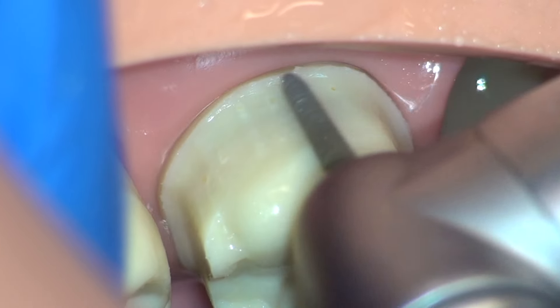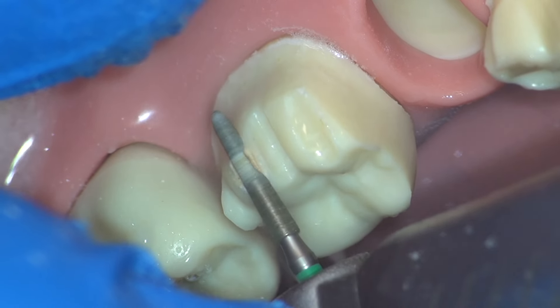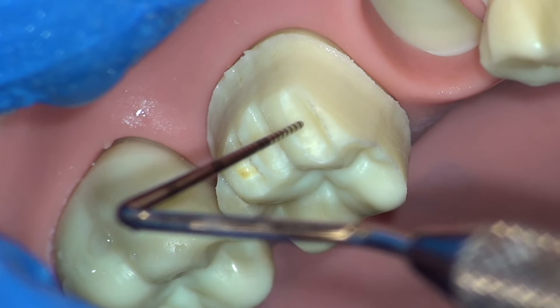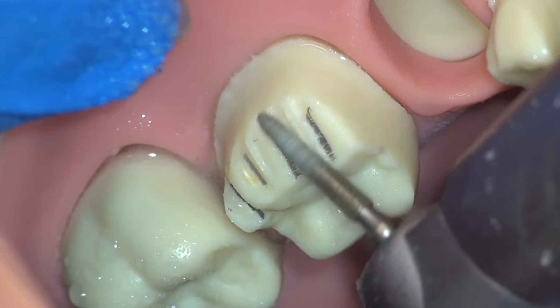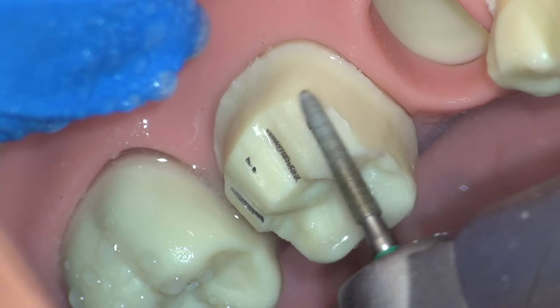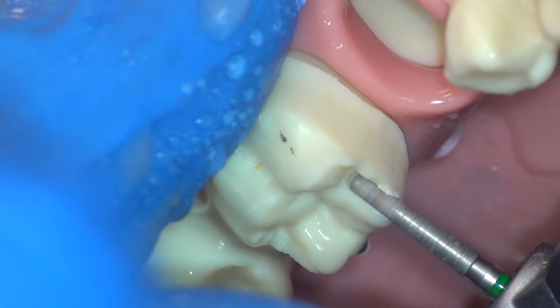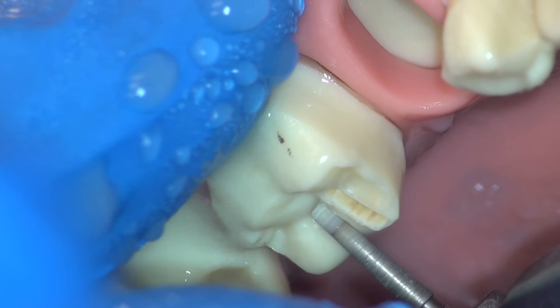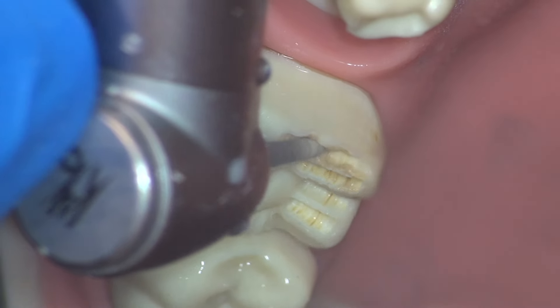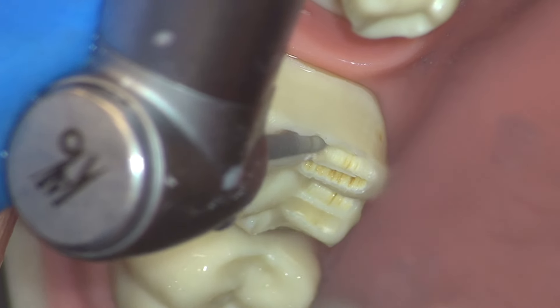Next, we move on to our functional cusp bevel. This functional cusp bevel reduction should be about 1.5 mm and we'll go ahead and set those depths now. We'll check with the probe to ensure that we are at the correct depth — again, we want to go to our final measurement at this time, and I marked that depth with the pencil in the same way as we did on the buccal. The lingual nonfunctional cusp should be reduced 1 mm, which is the width of the end of our modified shoulder bur, so we'll switch back to this burr for the occlusal reduction. We go ahead and set it to that depth of 1 mm and place similar depth grooves on the functional cusp, which should be reduced 1.5 mm. We'll check our reduction with the probe and modify as necessary to reach our final measurement at this step.